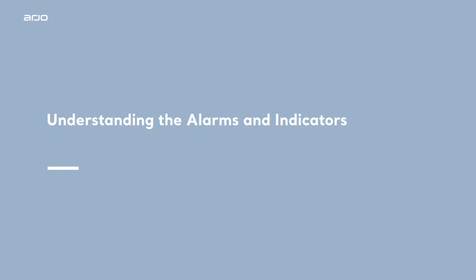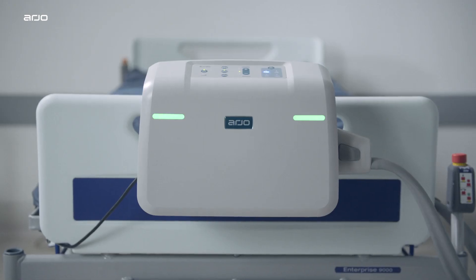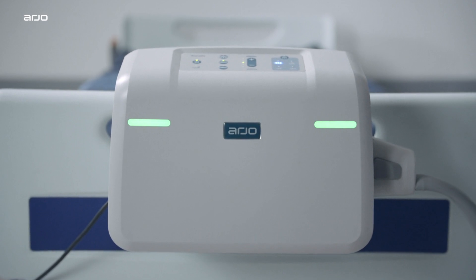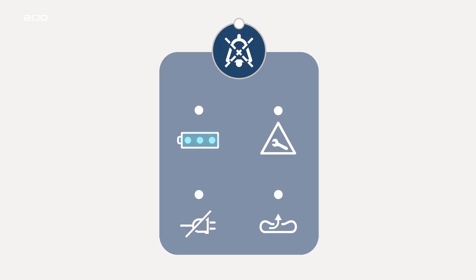Understanding the alarms and indicators. The power and alarm indicators are located on the top control panel and the front of the Oralis pump. The alarm indicators shown on the front of the pump are green when the pump is operating normally and yellow when there is an alarm condition. Blue indicators on the control panel indicate the charge status of the integral battery.